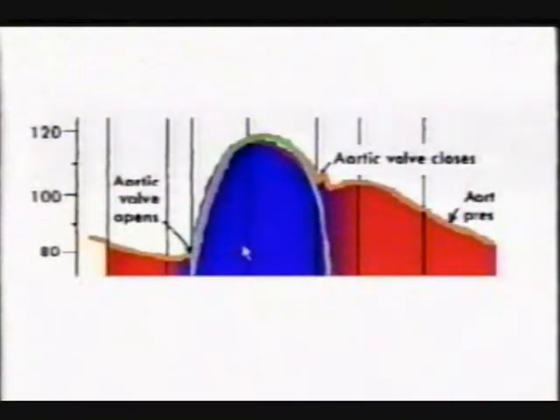The top portion of the previous graph represents the arterial pulse wave. Notice that the ascending limb of that pulse wave corresponds closely to the ventricular pressure changes. The descending limb, however, has a very different slope, not at all symmetrical with the first one.